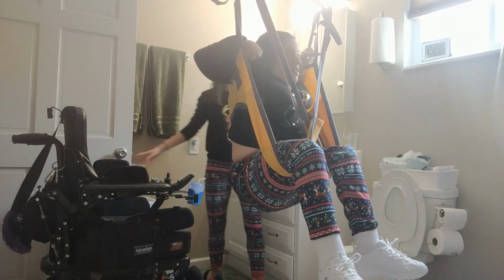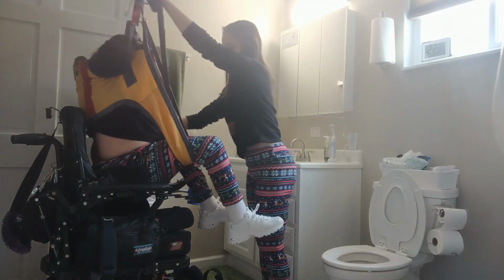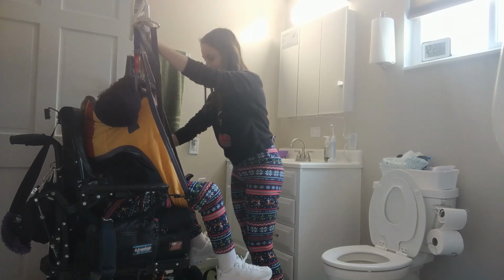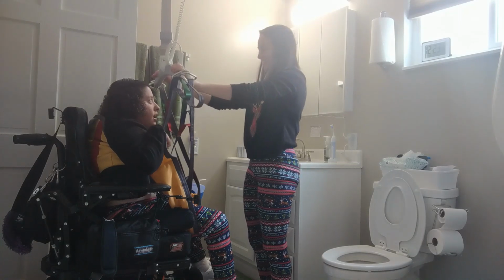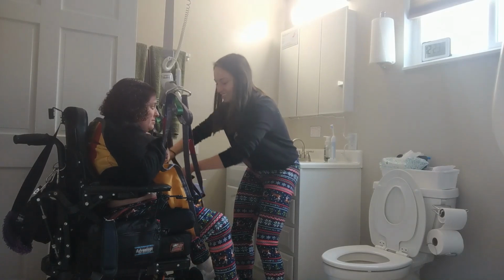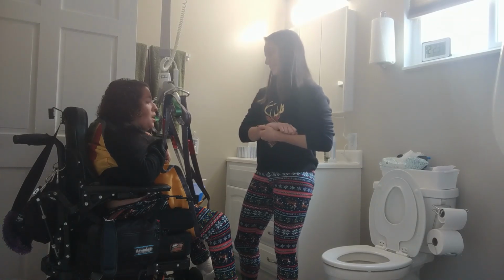You can go back to your chair. Yep. And then we slide me back into the chair, like so. And you push me back on in as we're going down. And then you would buckle her back in. Yeah. So make sure that she's buckled and her feet are strapped in before taking the sling off.